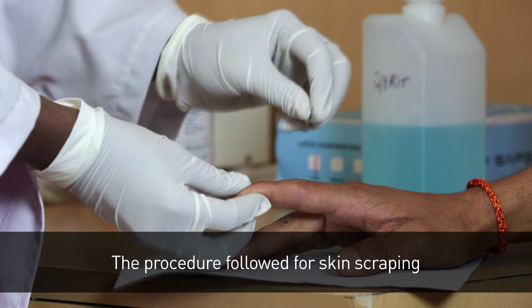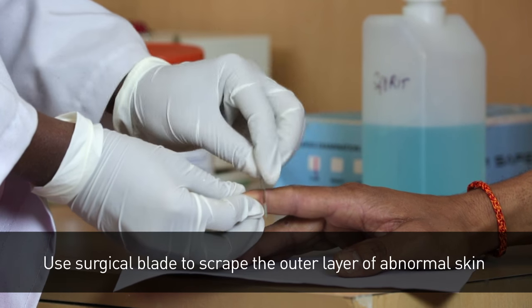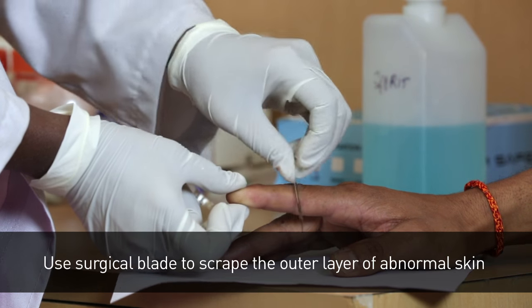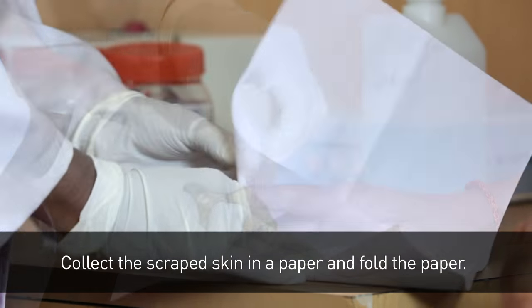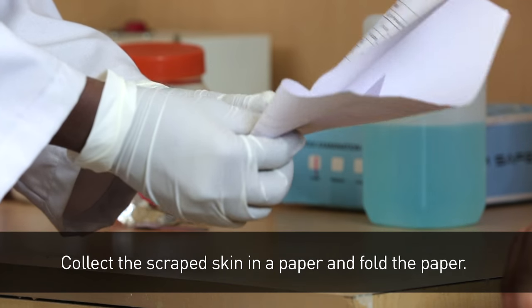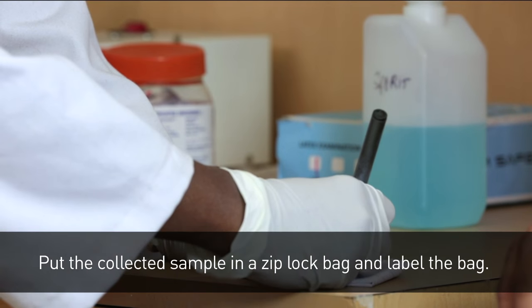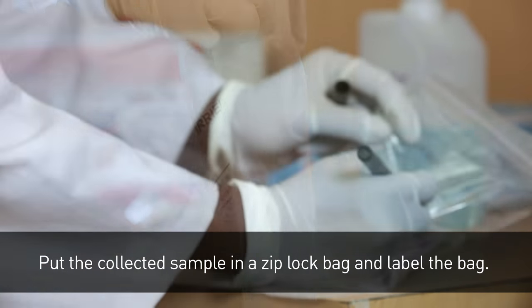The procedure followed for skin scraping. Use a surgical blade to scrape the outer layer of abnormal skin by holding the hand. Collect the scraped skin in a paper and fold the paper. Put the collected sample in a ziplock bag and label the bag.